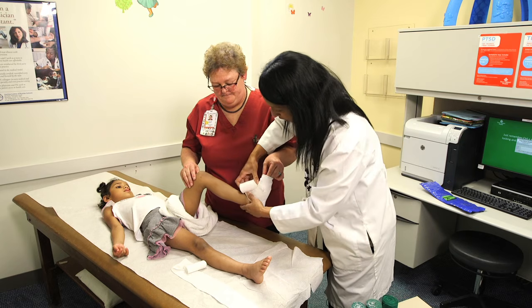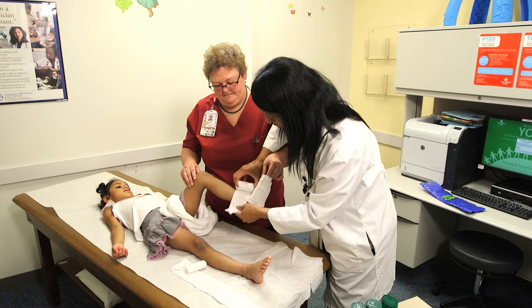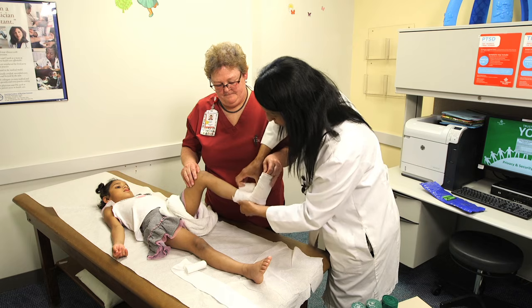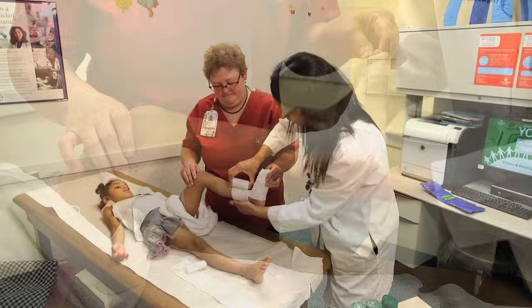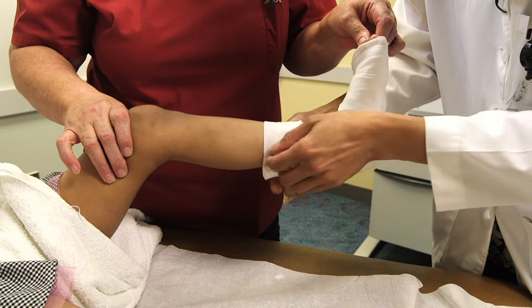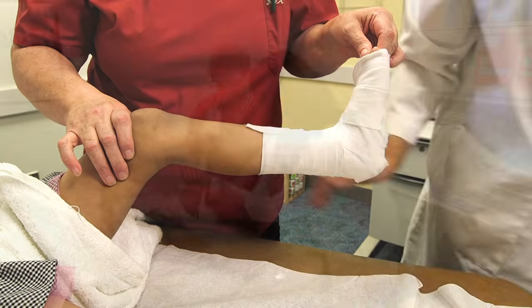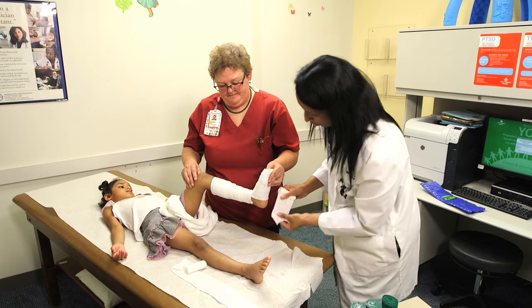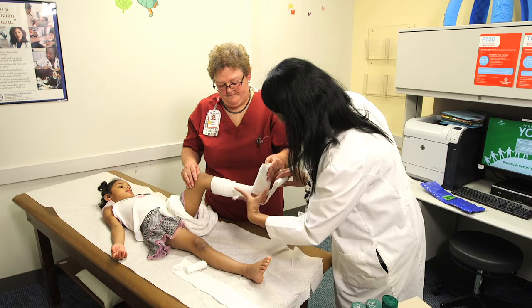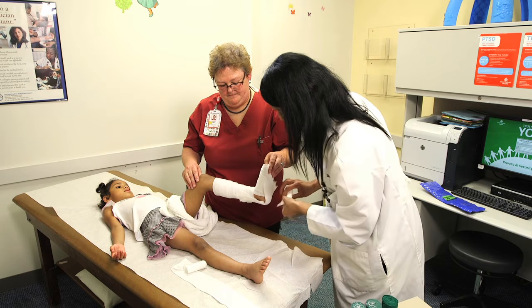You want to avoid getting too much splinting material in the front of the ankle because that can cause sores. But you want to put a lot of extra splinting material on the heel because that's an area that does develop sores. When you lay the material, you want it to lay flat with very few wrinkles. In areas like the heel where you want extra padding, you'll just break off pieces of extra splinting material to cushion that area.